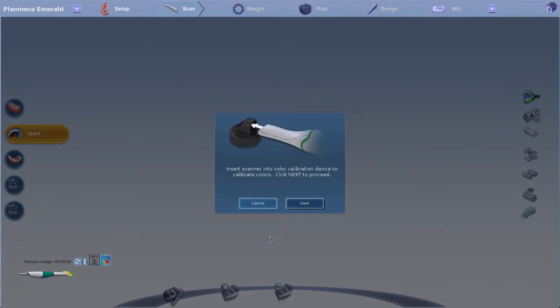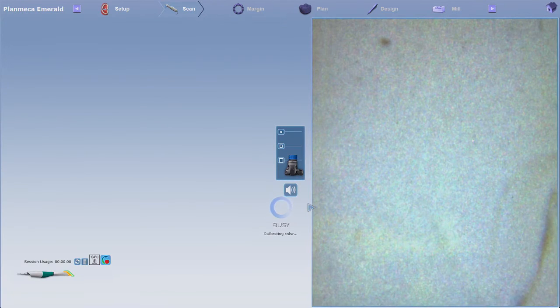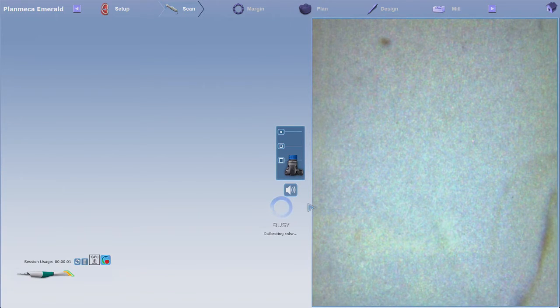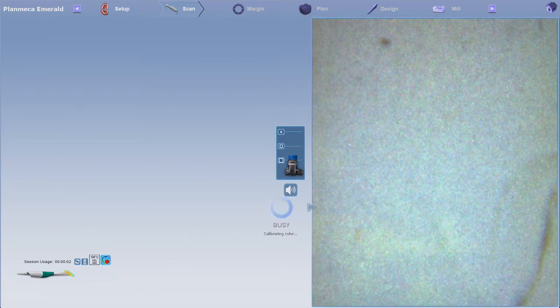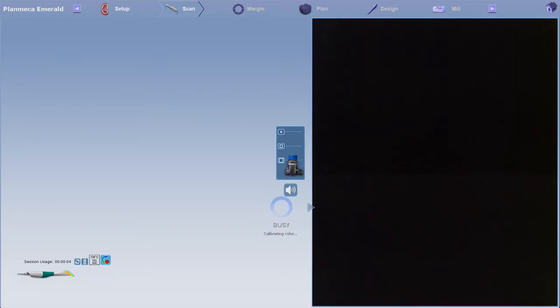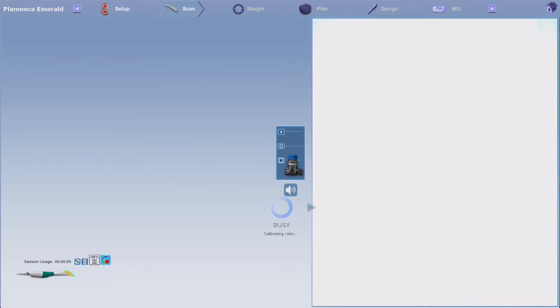The software will calibrate the color and check for accuracy. If you notice dust or debris in the live view, use air to remove it and rebalance.